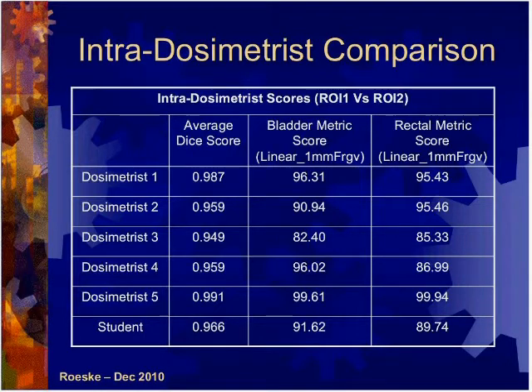If you look at the overall results, the Dice coefficient in the left column here, you can see they did pretty well. These are all values that are very close to 1. So amongst themselves, they were very consistent in contouring. Dosimetrist A versus themselves, very consistent. So we didn't see that as being an issue.